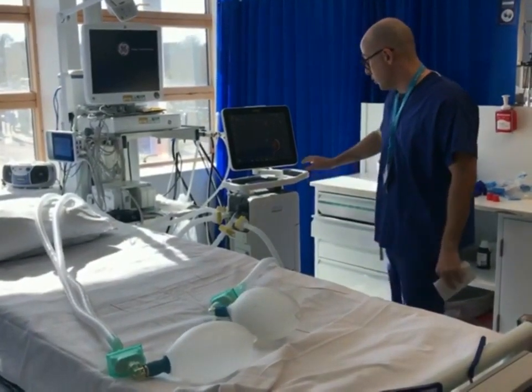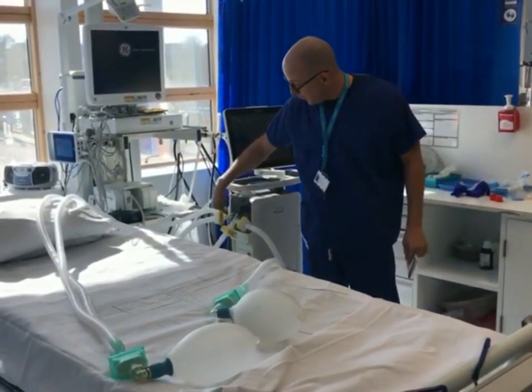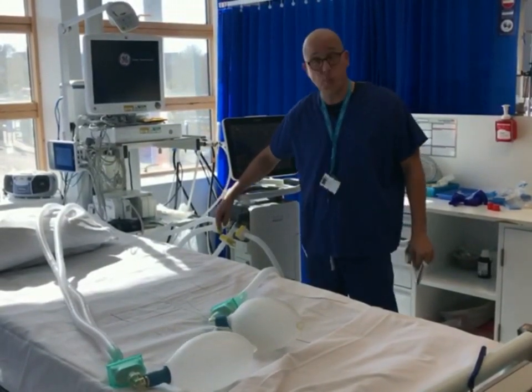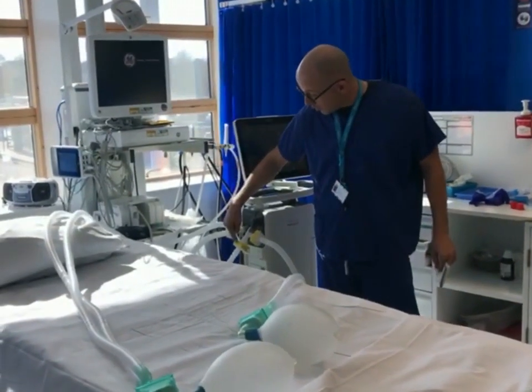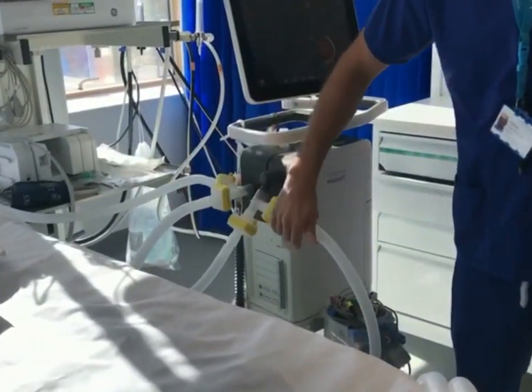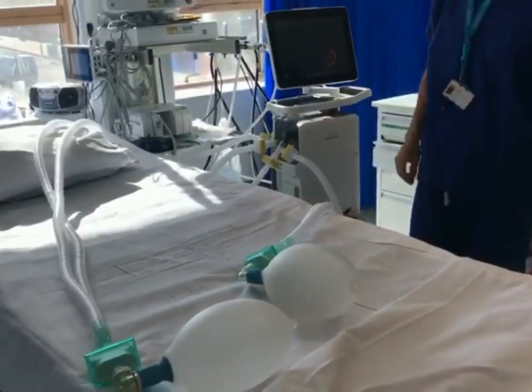What we have done is to use a Servo ventilator, to use two T-pieces in the in and out arms, and we have put four microfilters on all of them. In that way we have two different systems for two different patients.